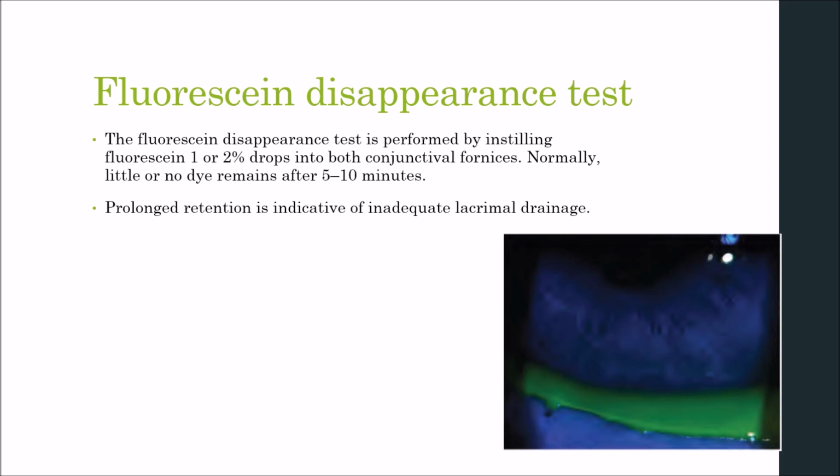The marginal tear strip of both eyes should be examined on the slit lamp prior to any manipulation of the eyelids or instillation of topical medications. Many patients with watering do not have obvious overflow of tears but merely show a high meniscus of 0.6 or more versus 0.2 to 0.4 millimeters normally, as shown in the figure here. You can see high tear meniscus, which is stained with the fluorescein.